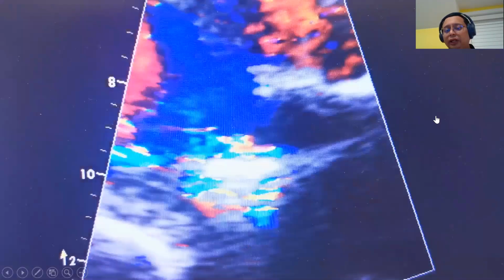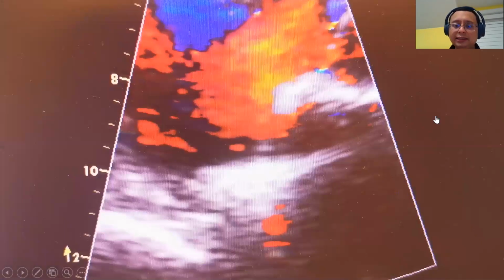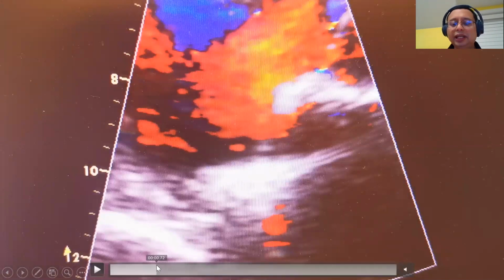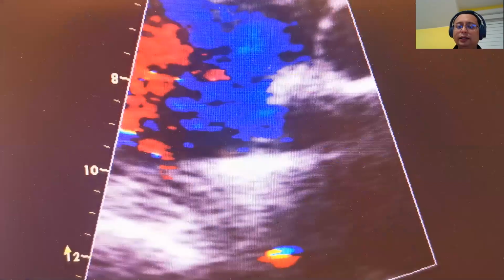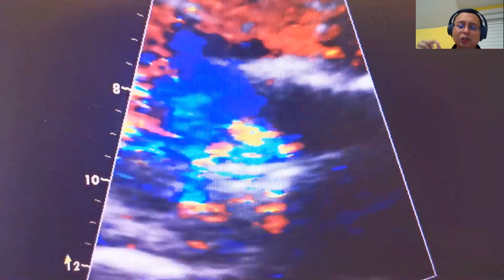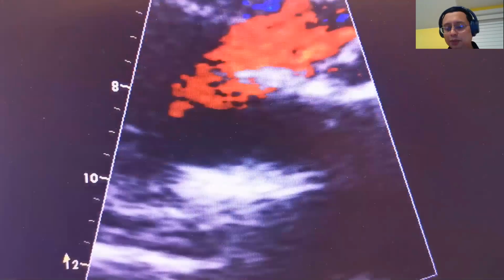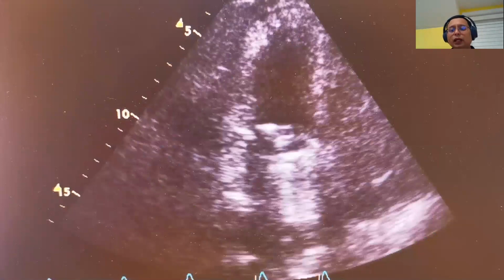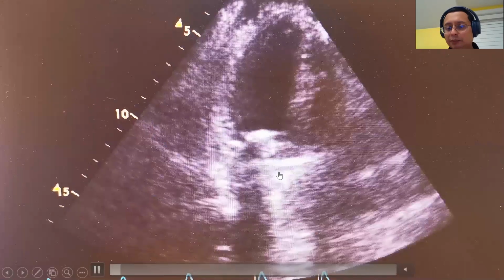Okay, so look at the flow across the mitral valve. Remember that a prosthetic valve by definition is slightly stenotic. So there is always what seems like a turbulent flow across the mitral valve. There can also be a little bit of regurgitation, what we call a washing jet. So why does the patient have a washing jet? This is to prevent the formation of thrombus. Okay. So again, this is a Mayo format. So there's a left ventricle. So that is a bileaflet.